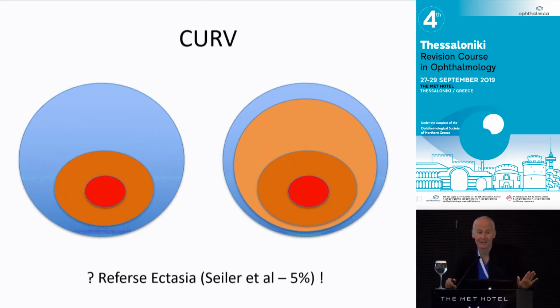One point to make about keratoconus manifest refraction is that optometrists are trying to refract coma as cylinder. And so you get a poor result in terms of acuity and an attempt to fit a toric lens shape over a coma aberration. What else can we do?